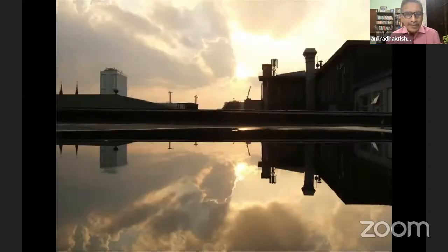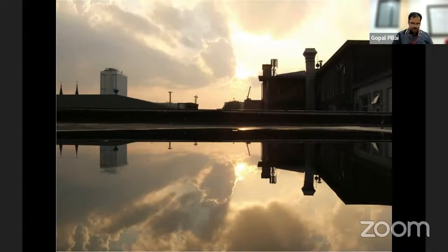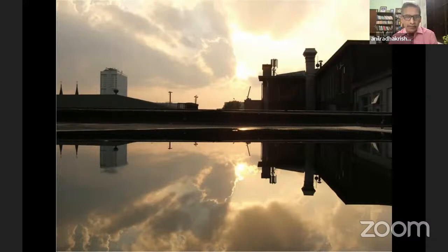If you look at this image, there is a series of buildings and the water there. This water body is reflecting whatever is in the foreground, just like a mirror. But if you see the image of this building, and over here the antennas and those metallic structures, these are not visible clearly. That is because of the imperfection in the water surface. So that is basically the principle of corneal topography.